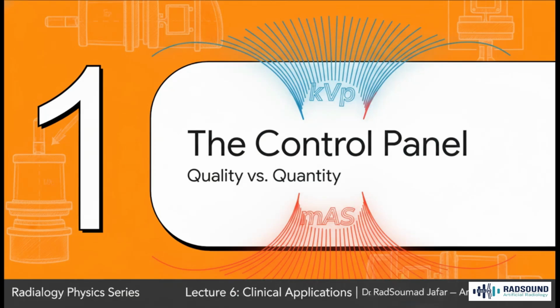Okay, let's start with the two most fundamental controls on any X-ray machine. These are the big ones. They determine the quality and the quantity of the X-ray beam itself. This is really the heart and soul of radiographic technique.